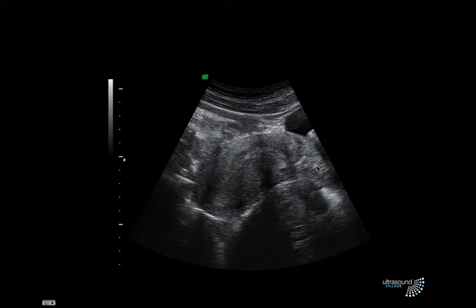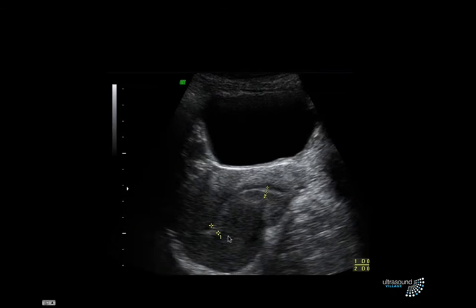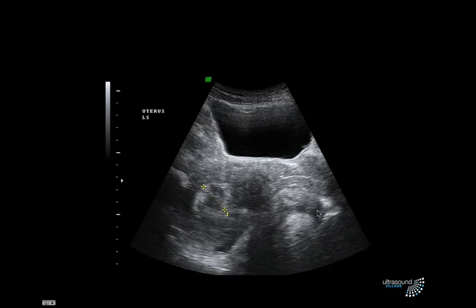Having said that, here is a retroverted uterus. There's some fecal material in the rectum here, emptyish bladder, but you can see this uterus is facing backwards. It's a retroverted uterus. And another one. There's a trace of free fluid here, retroverted uterus. Another retroverted uterus with the endometrium here. Another one, vaginal stripe, cervix, retroverted uterus, and the bladder.